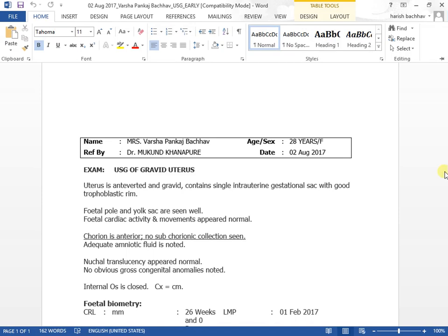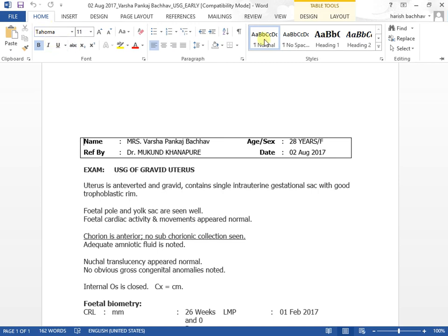So we have to just put findings which we got from sonography. And one more use of getting report open in the Word is that we can use all features of Word like auto-correction, spell correction, make particular sentence bold, which we are unable to do in other software.